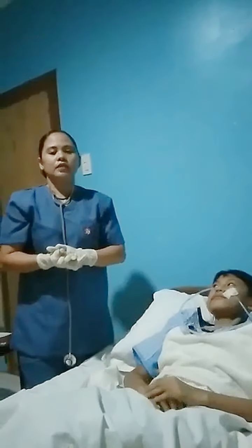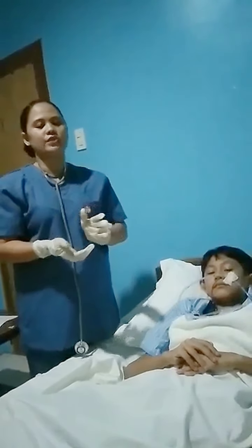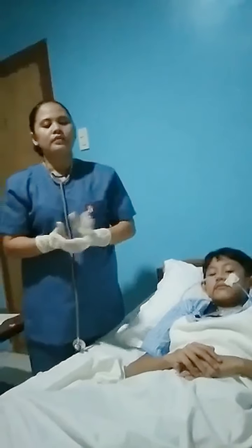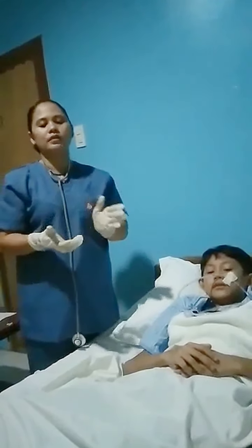After putting the patient in a comfortable position, we need to make sure to provide frequent oral nasal care. Because the patient's mouth and nose are expected to be a bit irritated since the patient is not breathing through the nose, or the patient is not eating using the mouth. So oral nasal care is very important. Next, we have to dispose of our gloves and wash our hands for infection control. After that, we have to do an aftercare and return all the equipment that we have used.